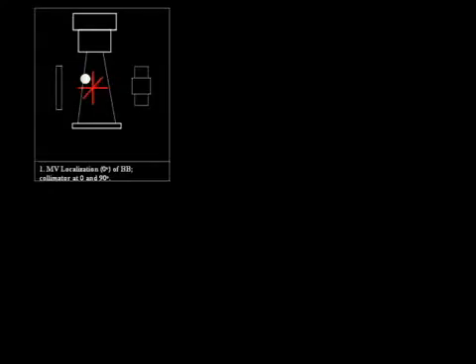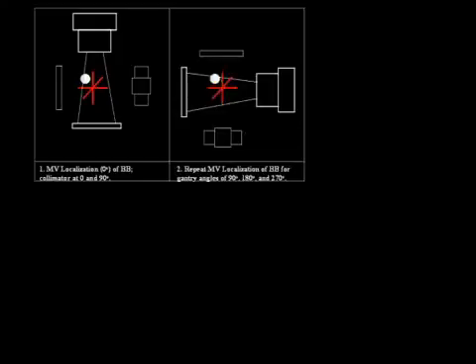So this is a cartoon that actually shows this procedure. One starts by placing a high contrast object as close to the isocenter as possible. And here the isocenter is signified by these 3 red lines, which are not laser lines in this particular case. But one can certainly align the object to the laser lines to start with. And then portal images are acquired of this object in order to define its position with respect to the beam edges, telling us where the object is with respect to the intended radiation isocenter.